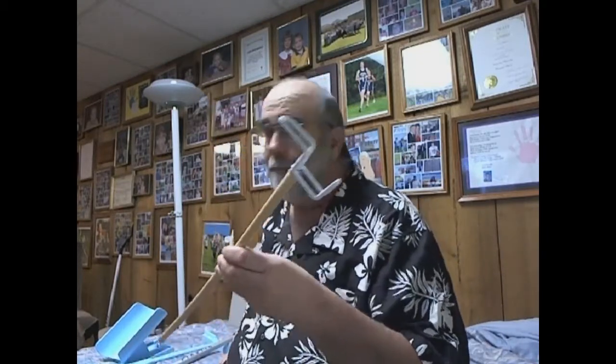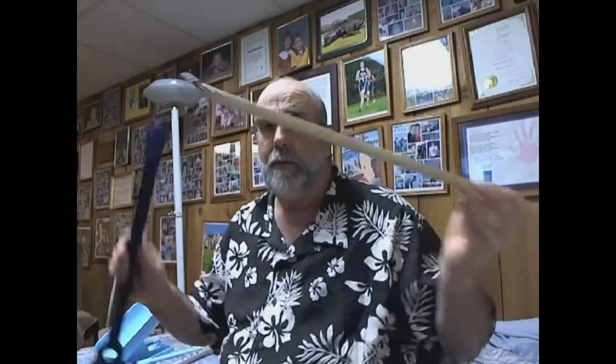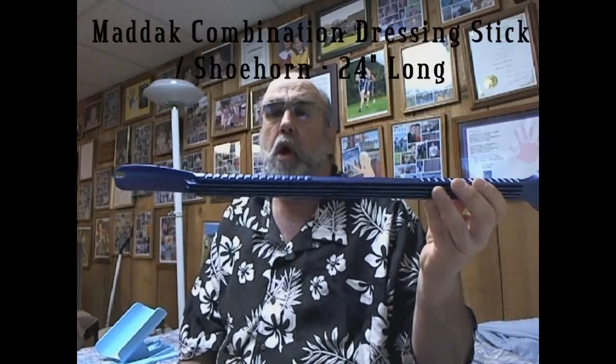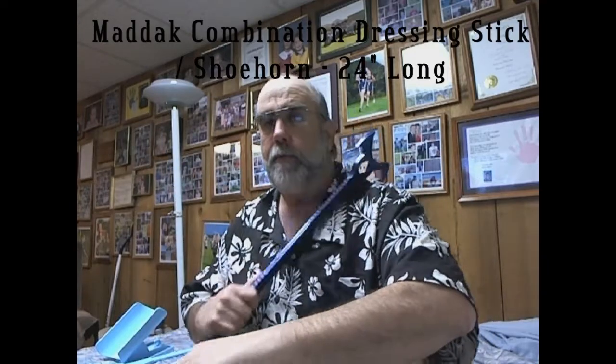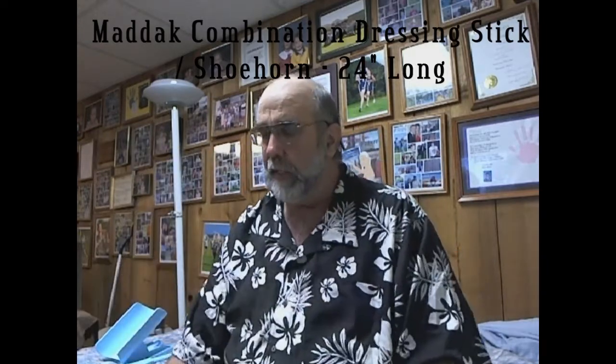However, I found this one over here to be much better. It's about 2 foot long. It's a reacher, pretty much like that. It's got little hooks on it for hooking your clothes and your socks and your pants. It's got an area where you can push if you've got to push a shoe off or push something else. Really good for grabbing. And on the other end is an essential tool. It is a shoe horn.